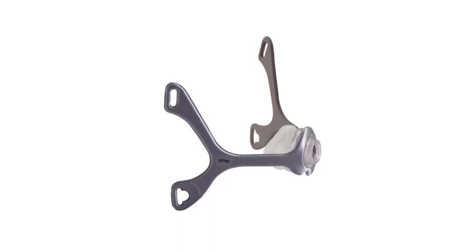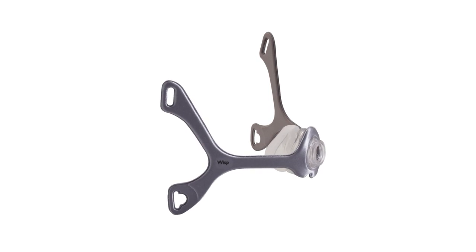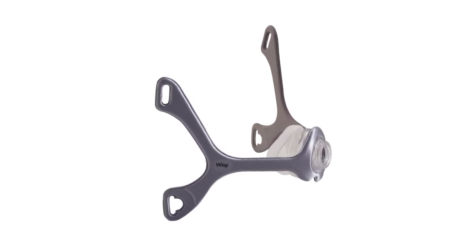Welcome. This helpful video will walk you through the proper fitting for your Philips Respironics Wisp Minimal Contact Nasal Mask.